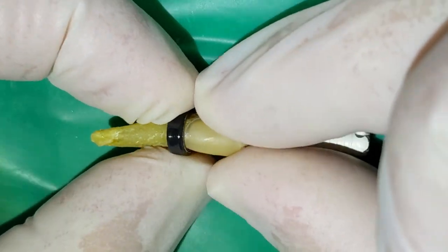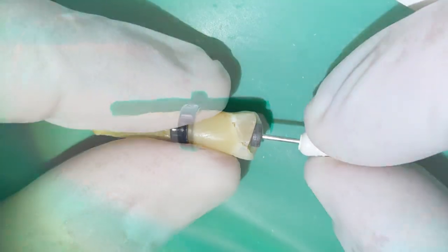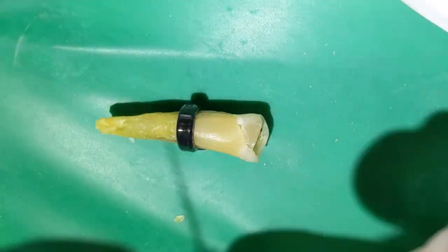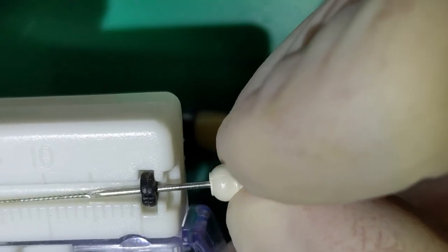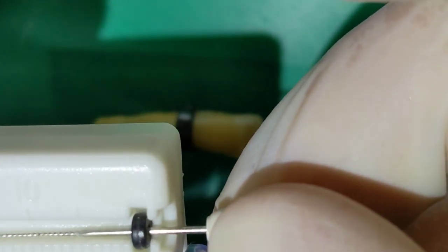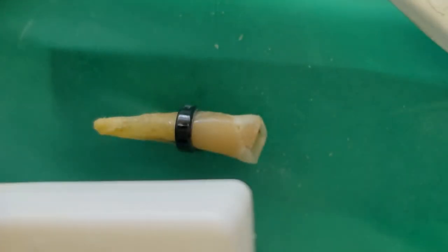Okay, so let me put the tooth back in my little clamp. And now we're ready to shape. Okay, so I'm using nickel titanium rotary files. These are made by Edge Endo. Measure the length. So we're right at about 24 millimeters in length for this initial file. That's what we set. The apex is a little bit further, but this is our working length, what we're going to clean to. So 24 millimeters.